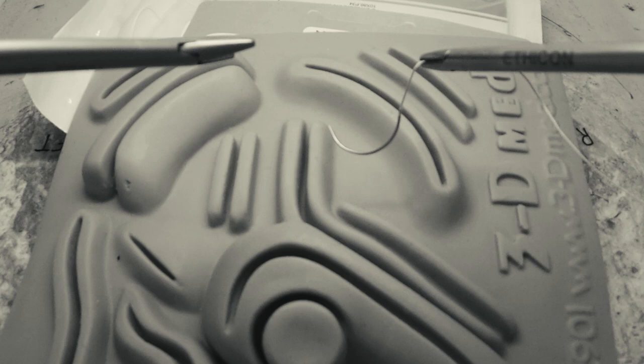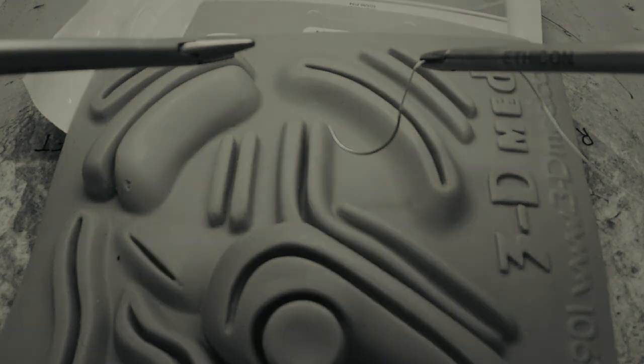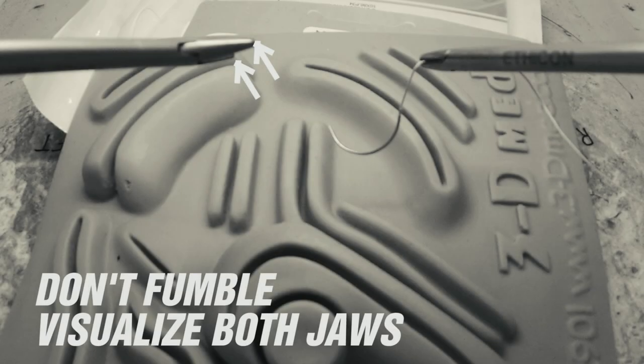Welcome to our tutorial on the basics of laparoscopic suturing. Begin by loading the suture in the driver of your dominant hand, grasping the suture about 2cm from the swage to pass through the trocar without getting stuck. It helps to visualize both tips of your driver to avoid fumbling.